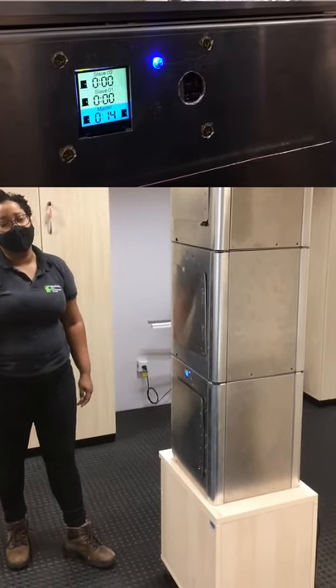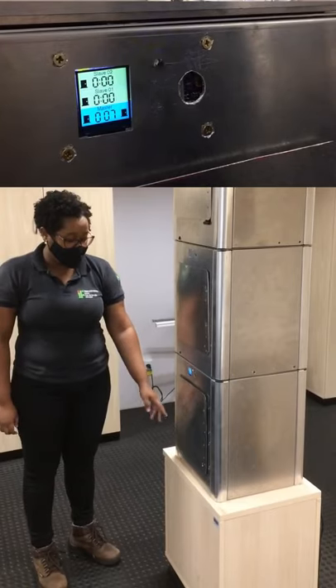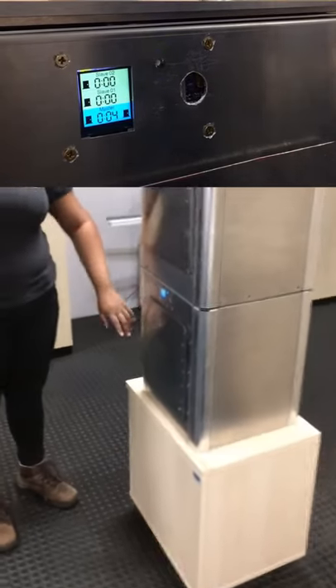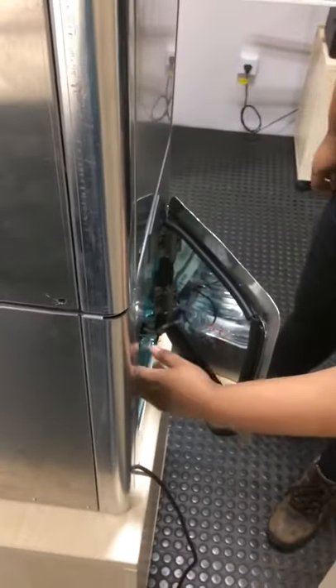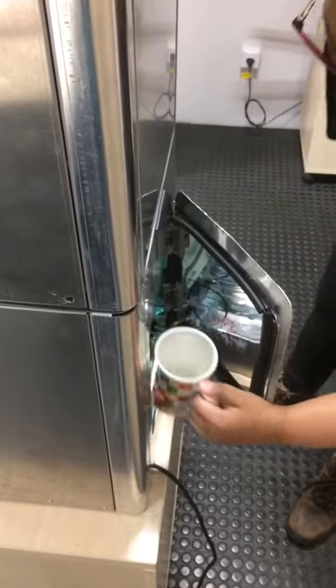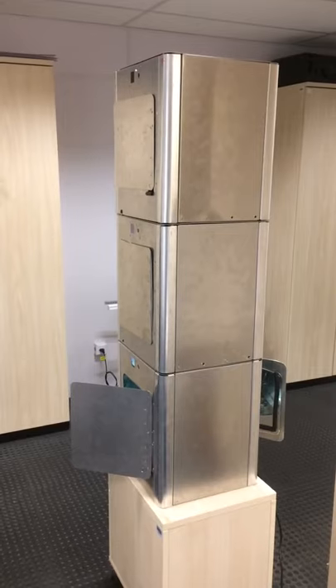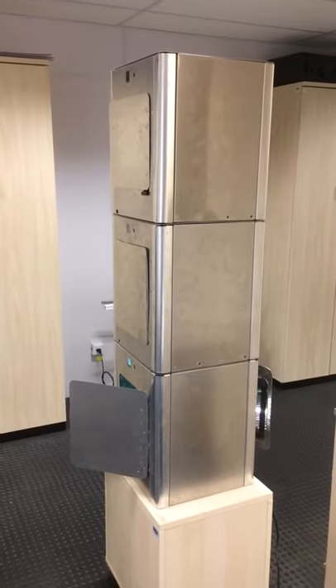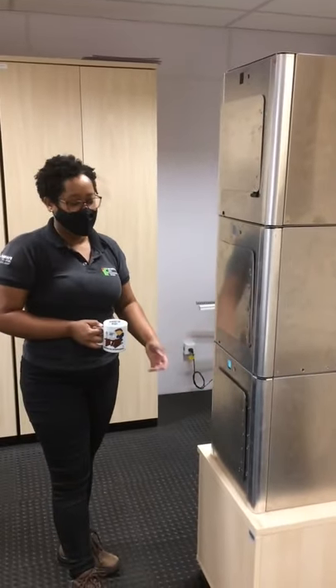O tempo de esterilização está com 17 segundos. A gente ainda vai realizar alguns ajustes na fixação das borrachas de vedação, por isso a gente pode observar alguns escapes de luz. Finalizada a esterilização, a gente retira o material pela porta do fundo. A gente pode ver agora o fechamento automático das portas do módulo mestre.